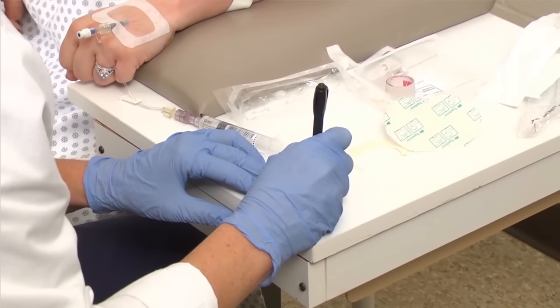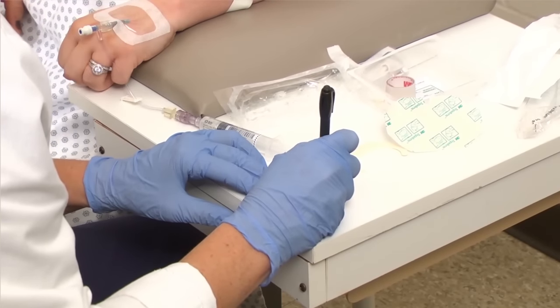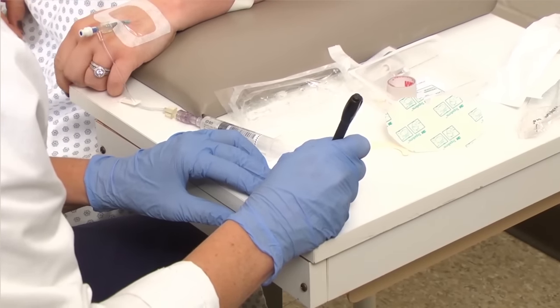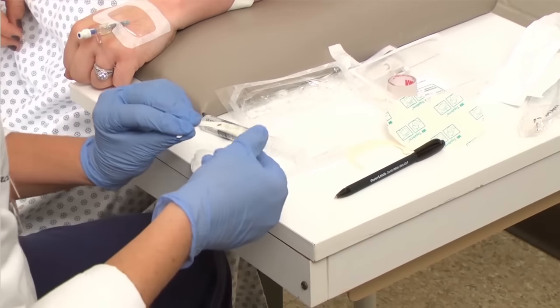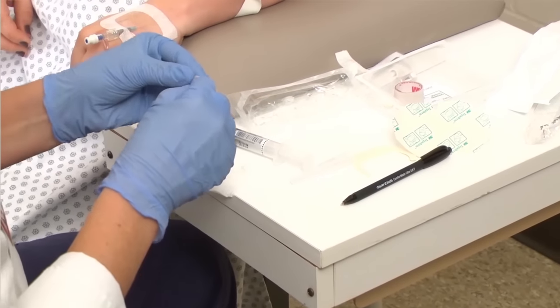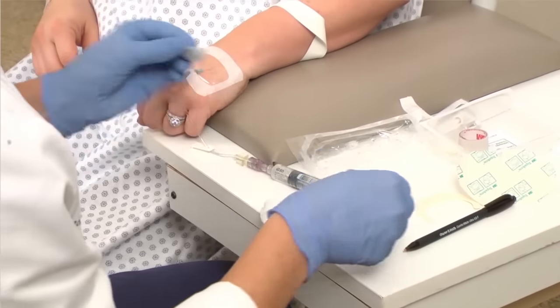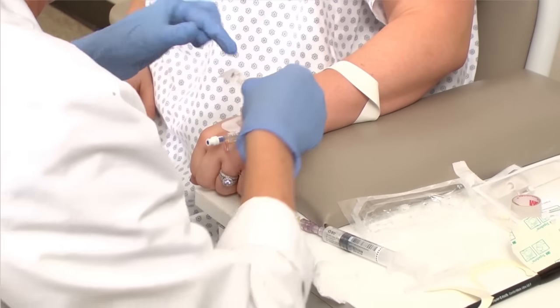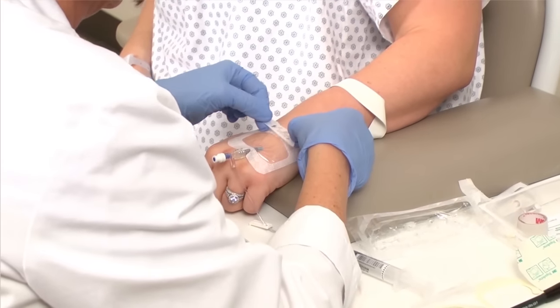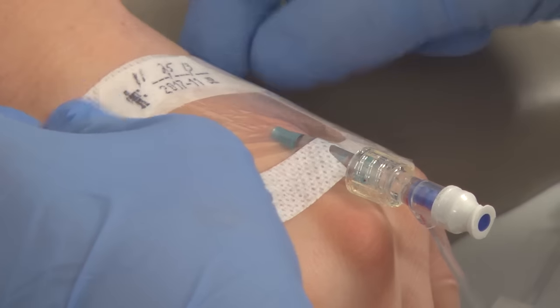Once the angio is secure, you can fill out the date and time sticker. Remember to do this before affixing it to the dressing. When applying the sticker, place it so the insertion site can be seen and assessed.